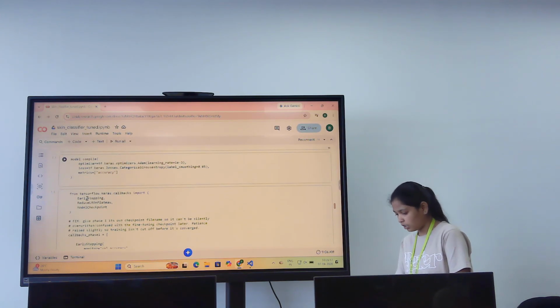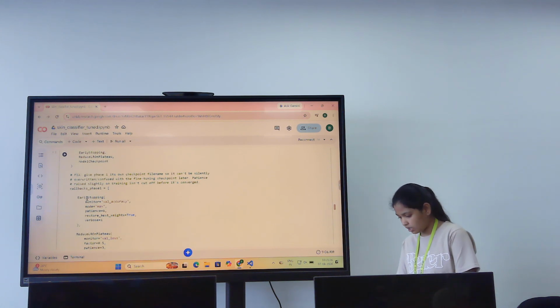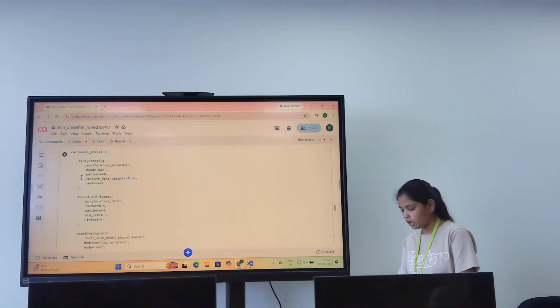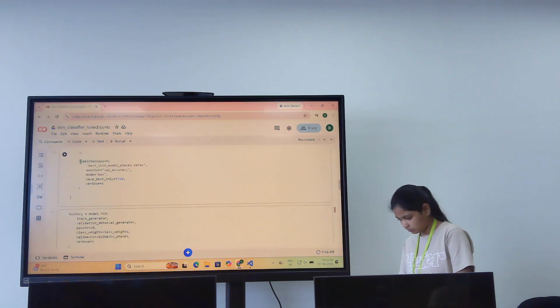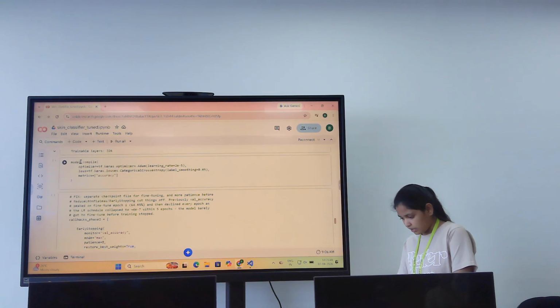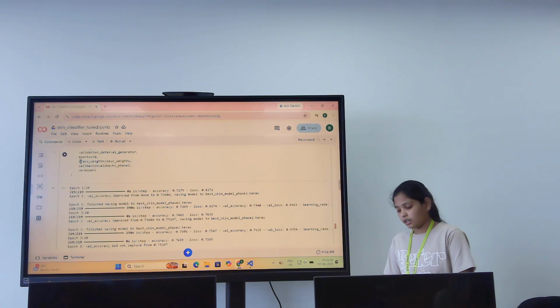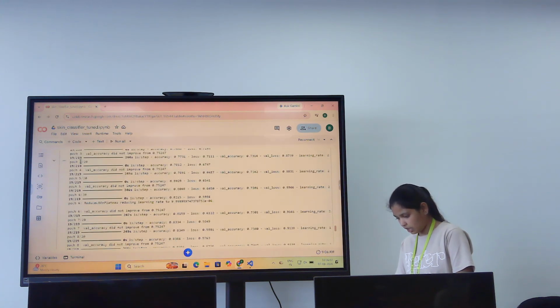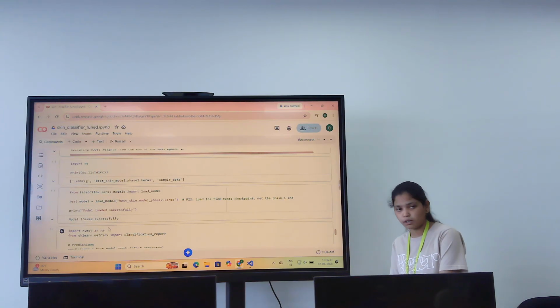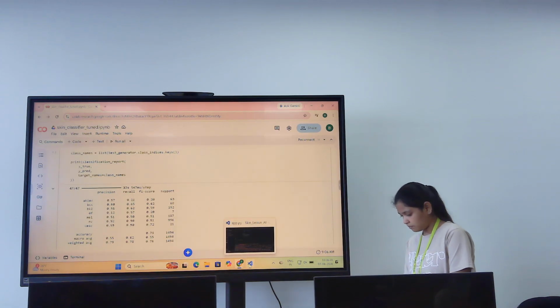I trained the model in 2 phases. In phase 1, I froze the EfficientNet B3, and I also included the early stopping method. And in phase 2, I used EfficientNet B3 to improve my accuracy, and I did my fine tuning. After I got my best model, I developed my front end system using it, and this is my classification report. Let me show my front end system.